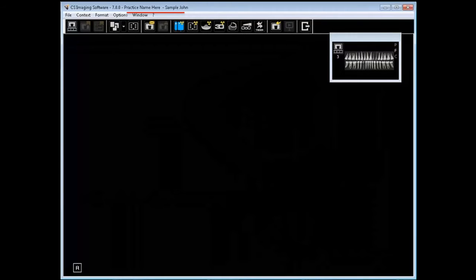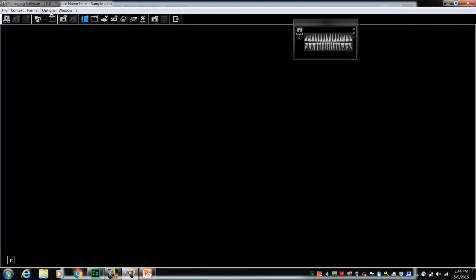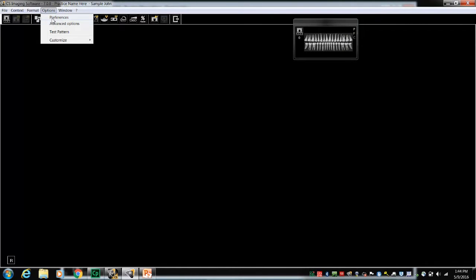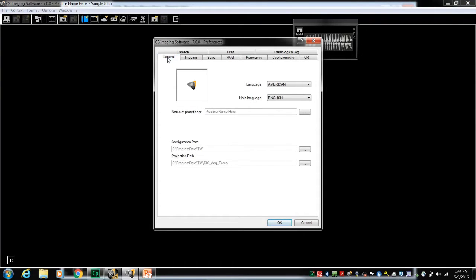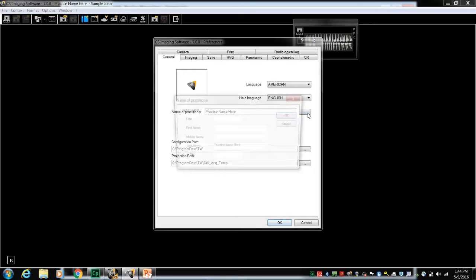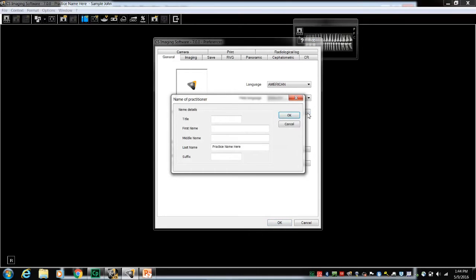Let's take a look. From the Options menu, select Preferences. Select the General tab. Select the button to the right of Name a Practitioner. For single doctor practices, complete the fields as labeled. For a practice name, utilize the Last Name field.